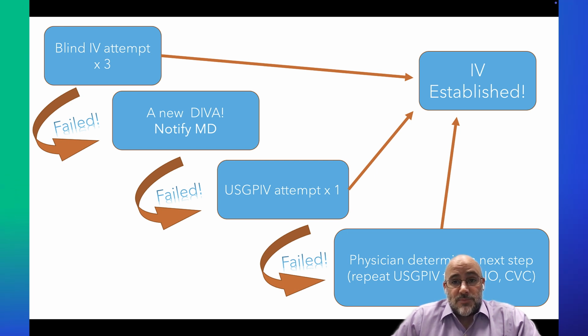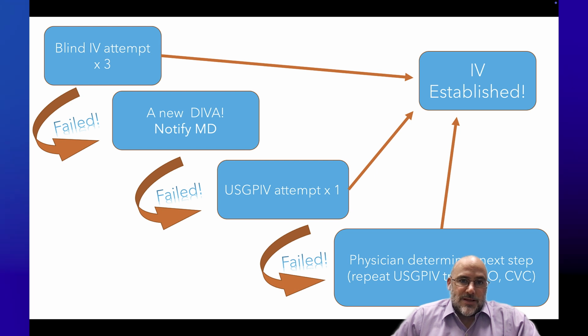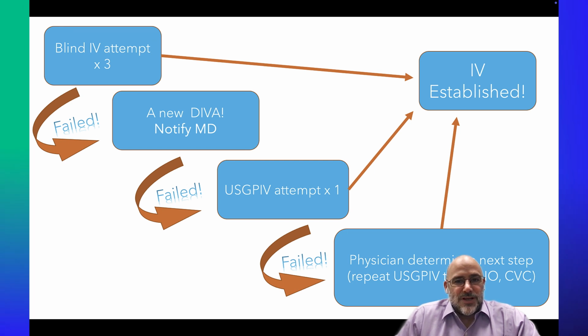It's fine to do that, but just be aware that as you use up more proximal spots, you're making it more difficult to use the more distal spots for the patient. So just be aware that each ultrasound-guided peripheral IV attempt is using up some valuable real estate. So let's make sure that we're doing what's in the patient's best interest.